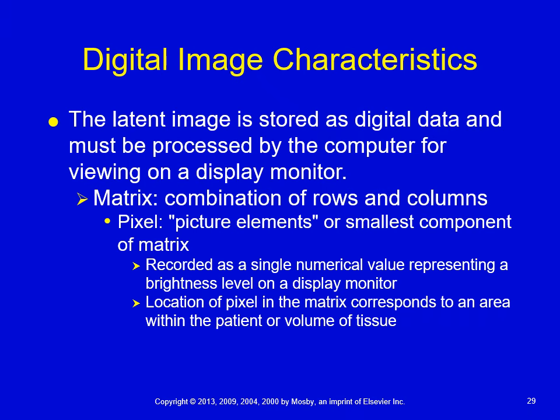Think about when you're taking a picture with your phone and you're zooming in really far; eventually you'll start seeing tiny squares, or pixels. Sometimes when we send or receive images and the image quality is degraded, we can see the individual pixels.